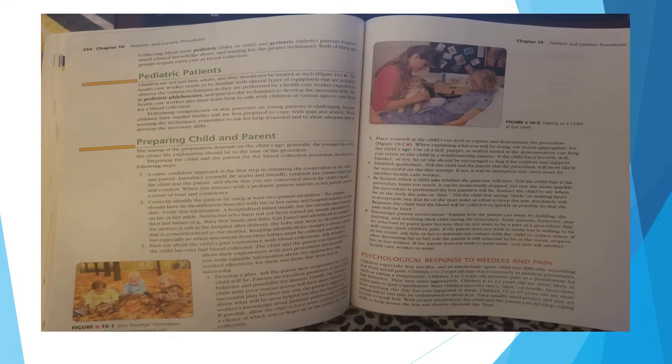Number 4, develop a plan. Ask the parent how cooperative his or her child will be. Parents are excellent predictors of their child's behavior and possibility for distress. Usually the younger child with poor venous access will have more distress. A successful plan involves not only the parent's suggestions about what will be most helpful, but also the healthcare worker's knowledge about pediatric phlebotomy techniques, if possible. Allow the child to have some control by offering a choice of which arm or finger he or she prefers for blood collection.